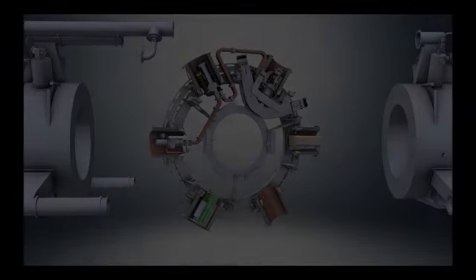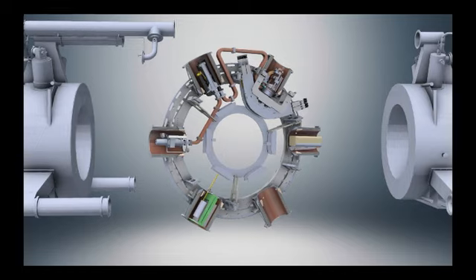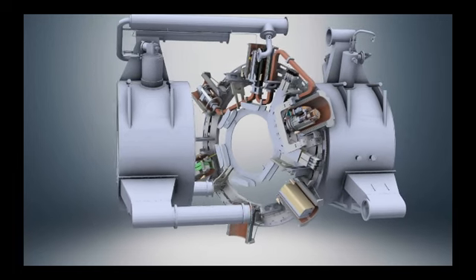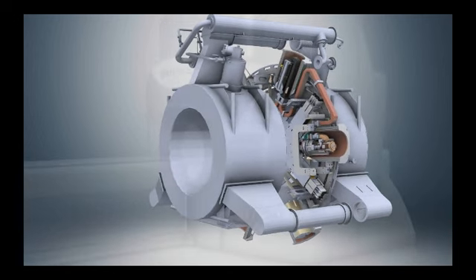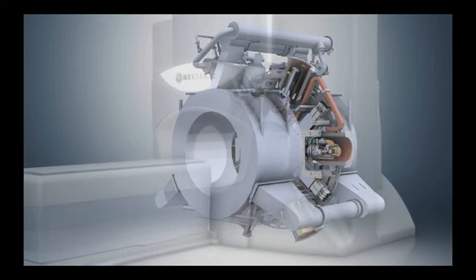Here I'm showing the inside of the unit from one of the vendors. And if you look closely here, you'll see our old friends, the klystron, the circulator, and the waveguide all lined up around the edge. And this whole ring goes in between 2 poles of the magnet on the left and the right, and that provides the ability to image and treat on the same unit. As you can imagine, there are some significant engineering challenges that go with operating a linac in the presence of a magnetic field, but that's been largely solved.